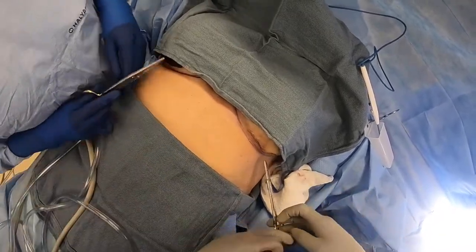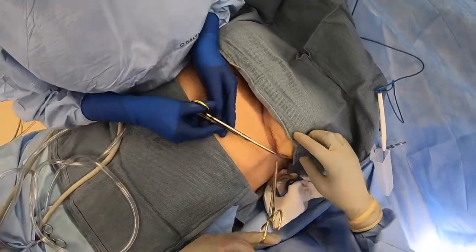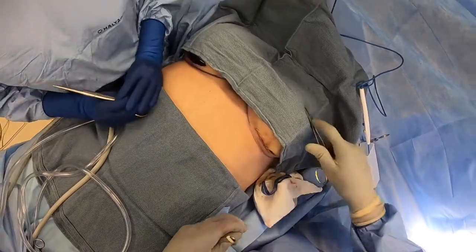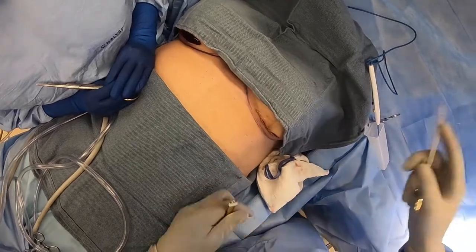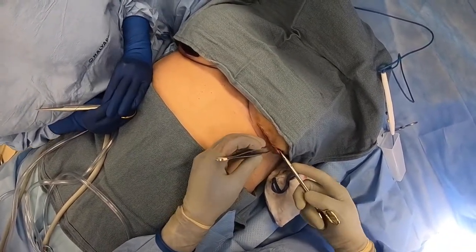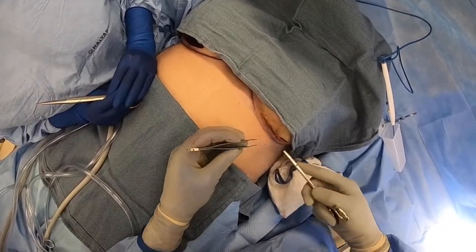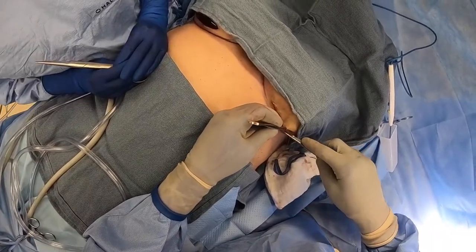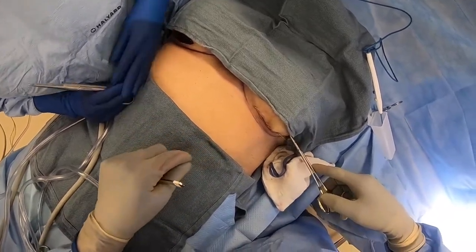I'm doing a deep buried dermal suture. The knot is deep, and the technique is tactile - she feels the knot and then she cuts. She almost doesn't even have to look when she cuts. We cut these right on the knot because we don't want the knots to spit out through the skin. I'm going to do a deep dermal - deep to superficial, superficial to deep - and the knot is going to be underneath when I'm done tying it.